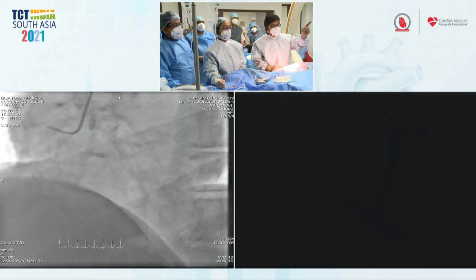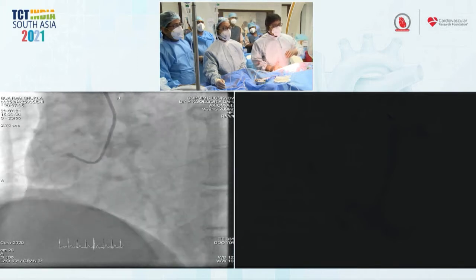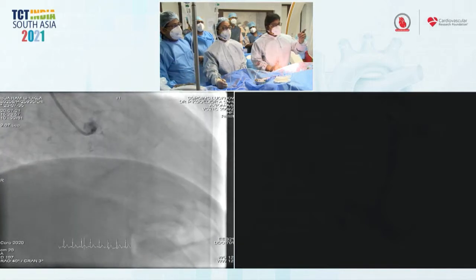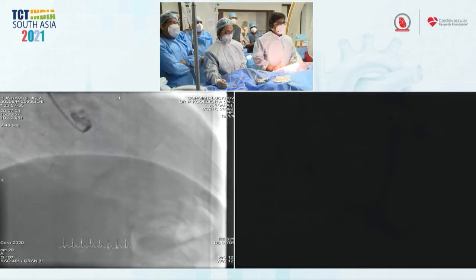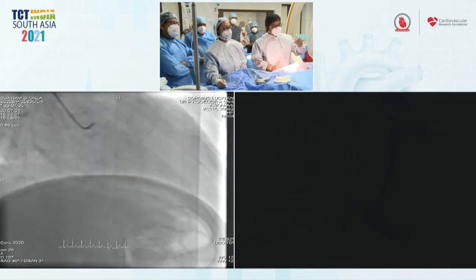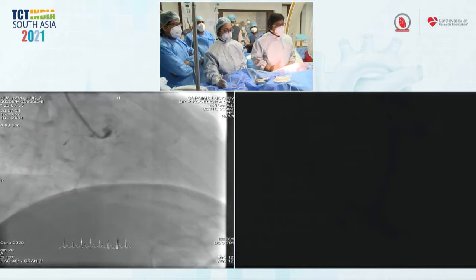That's the right. So we knew it is occluded. That's the right injection, in LAO and RAO, please. So the right is occluded. There are some bridging collaterals, as you see, and through the bridging collaterals some flow goes antegrade, but then it mixes with the retrograde flow, largely from the opposite side. We can stop that, and you can have thoughts on that. What is to be done for this patient?